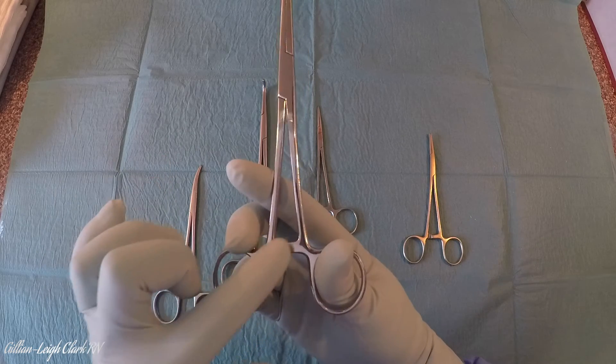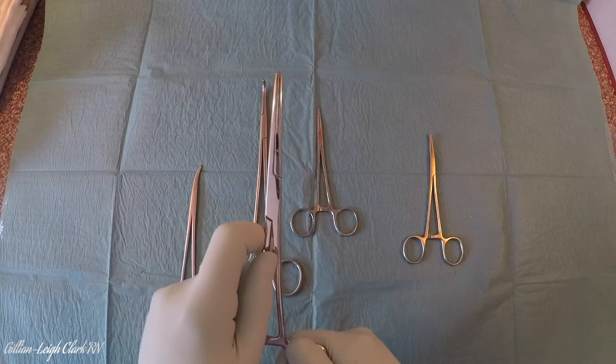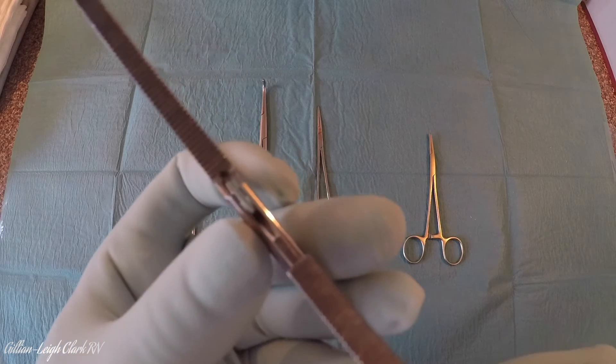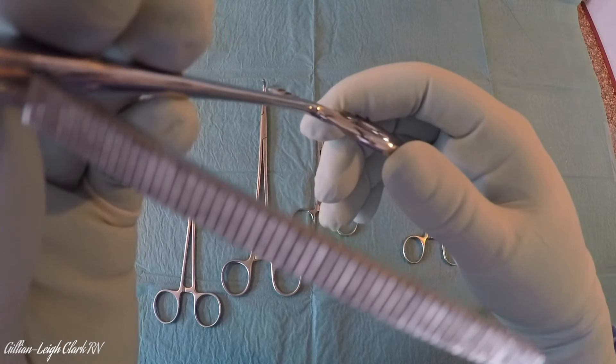So: scissor-like handles, a ratchet, and the other key giveaway for an artery forcep is horizontal striations. If I open up this — this is a straight Spencer Wells, just a medium-sized artery forcep — and bring it close, hopefully we can just see its jaws. Here we have these horizontal striations.